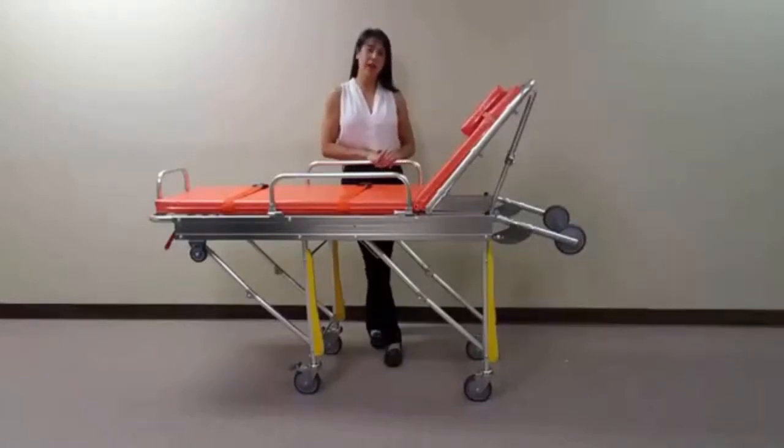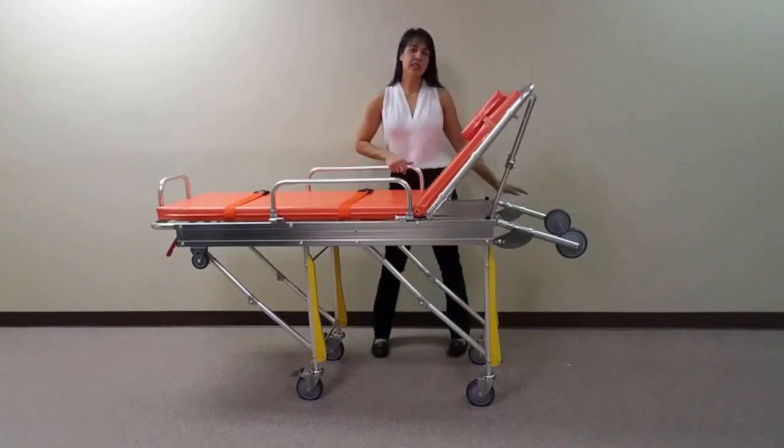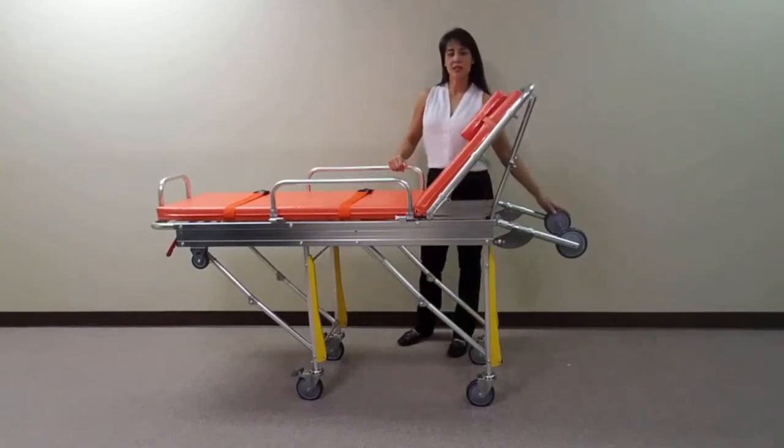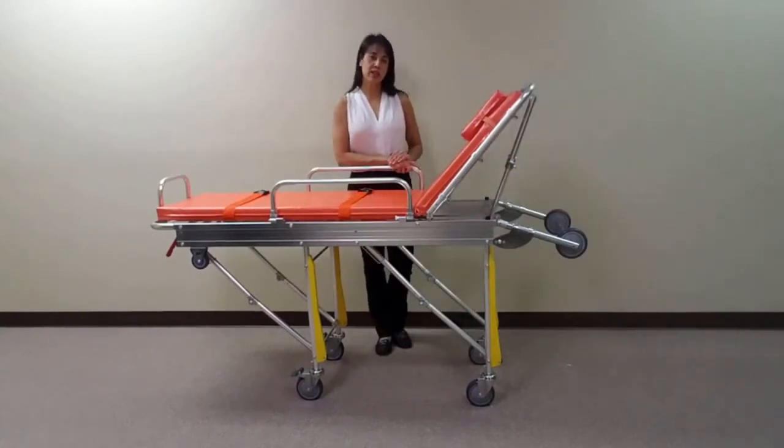Today we're going to walk you through the basic features of the MS-3C-153B, our lightweight ambulance stretcher. This stretcher is designed for transporting individuals to and from appointments without the hefty cost of EMS ambulance services. The MS-3C-153B has a maximum vehicle loading height of 26 inches and is designed to be used primarily in transportation vans.